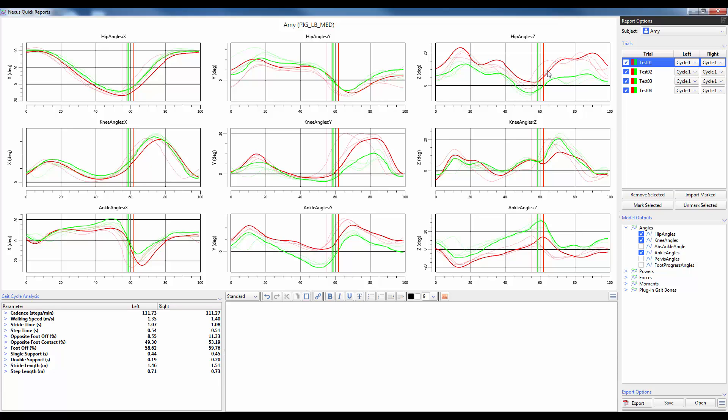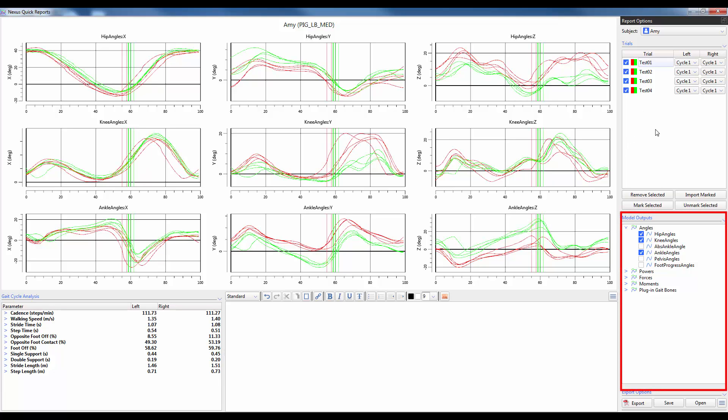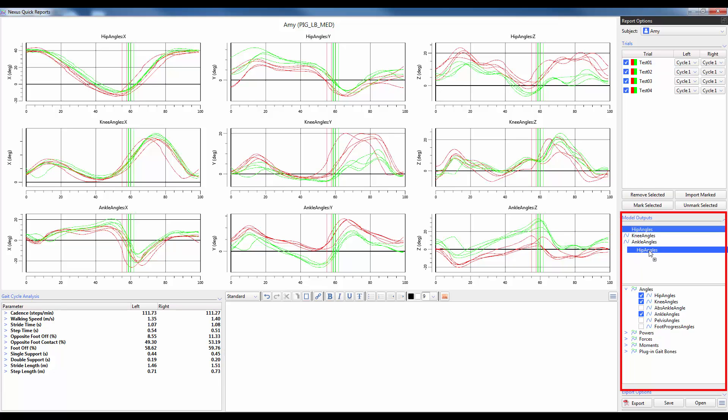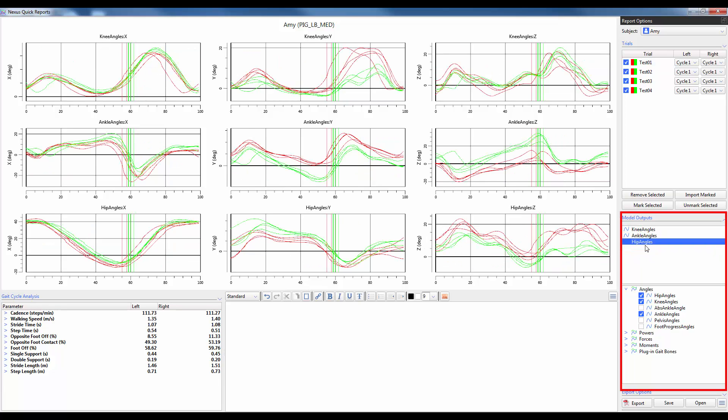If you want to change the order in which your model outputs are displayed, expand on the model outputs dialog and then you will see which model outputs you have selected. Simply drag and drop the order in which you wish your model outputs to appear. So now we can see that we've got knee, ankle and then hip. This is automatically reflected again in the main window.